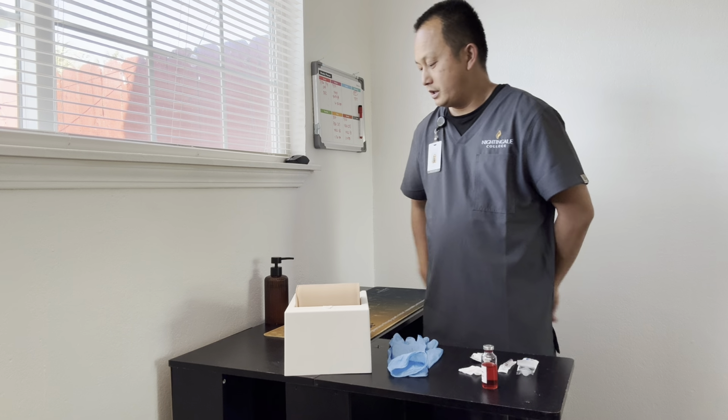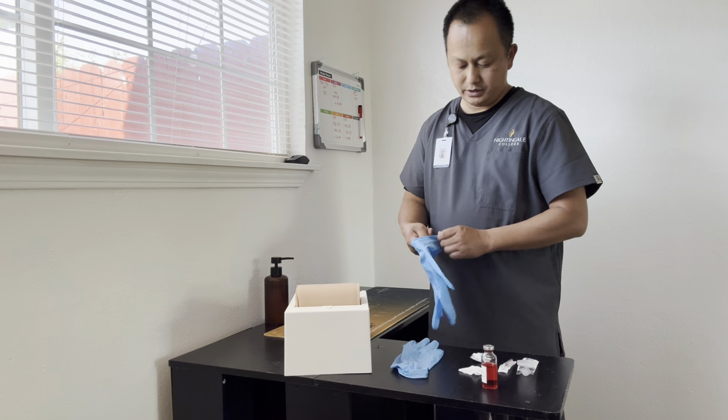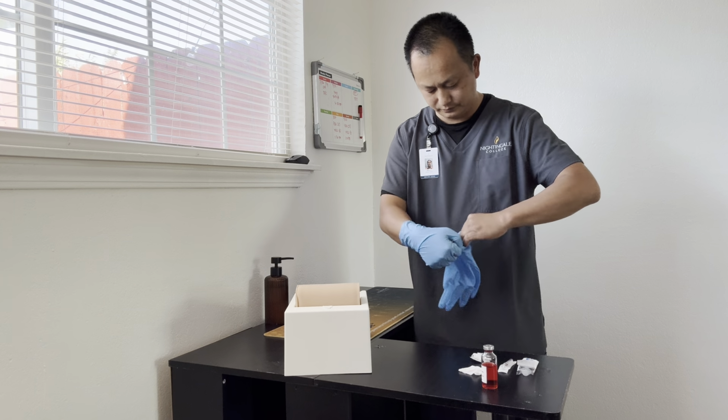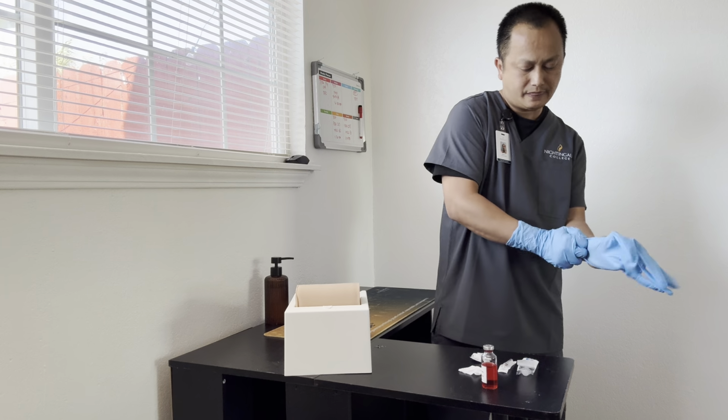Okay, none? Okay. So I'm going to perform hand hygiene. We're going to go ahead and don our gloves. And I am going to take an alcohol pad.